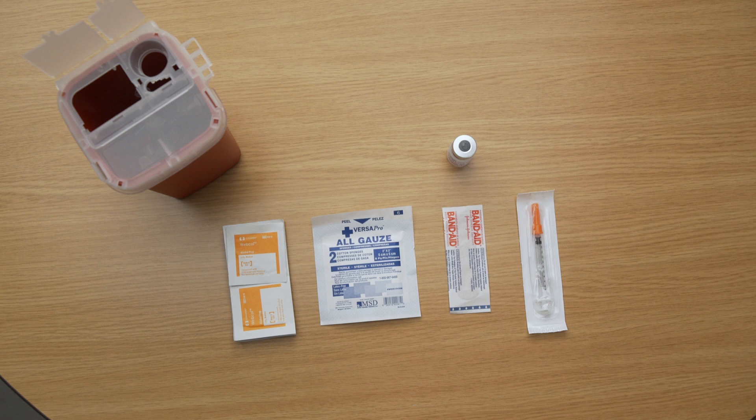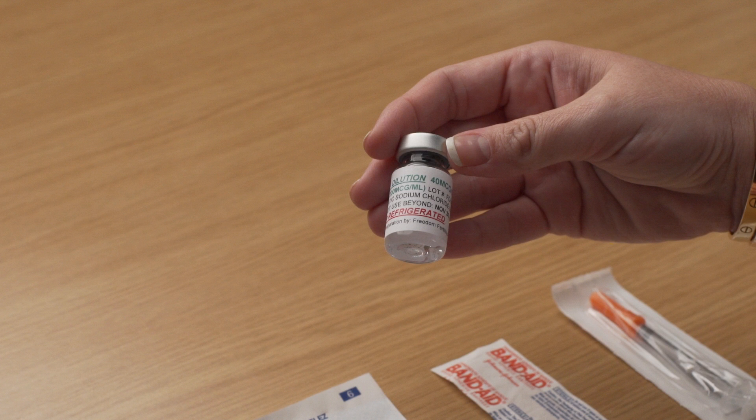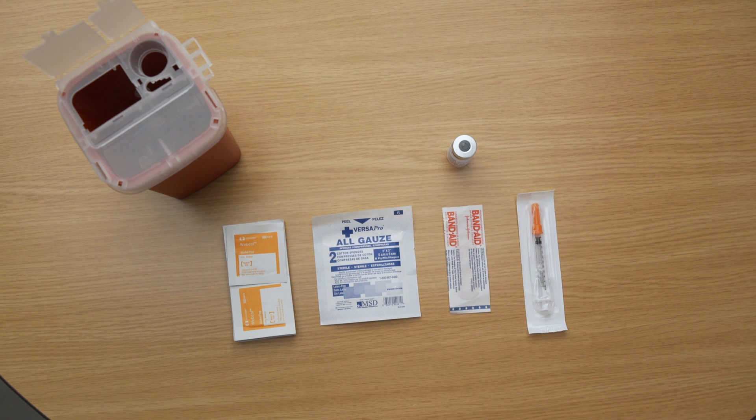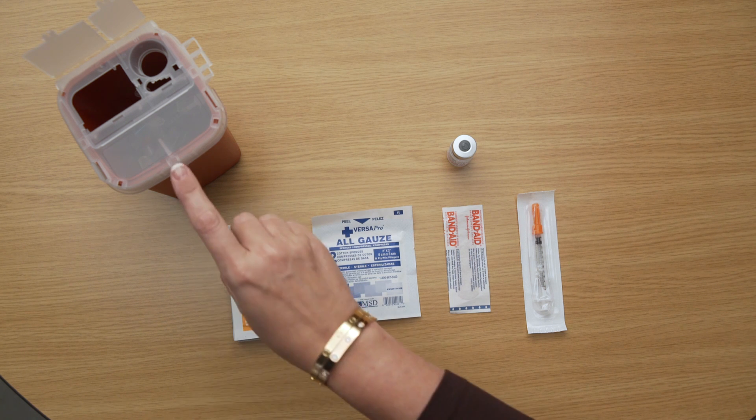Before you begin, be sure to have all of the following items: one multi-dose vial of Lupron, also referred to as Leuprolide acetate — vials are typically 2.8 milliliters — an injection syringe marked in units, alcohol swabs, sterile gauze, and a safety container.